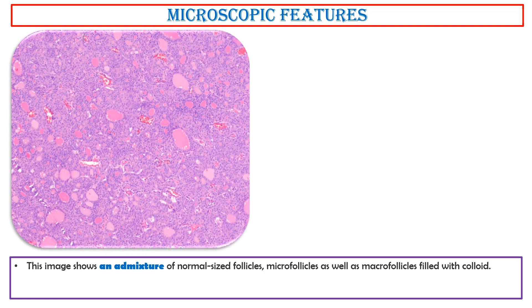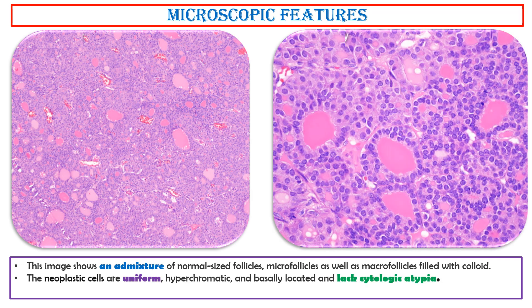Microscopic features. This image shows an admixture of normal-sized follicles, microfollicles, as well as macrofollicles filled with colloid. The neoplastic cells are uniform, hyperchromatic, and basally located, and lack cytologic atypia. Mitotic activity is not increased.